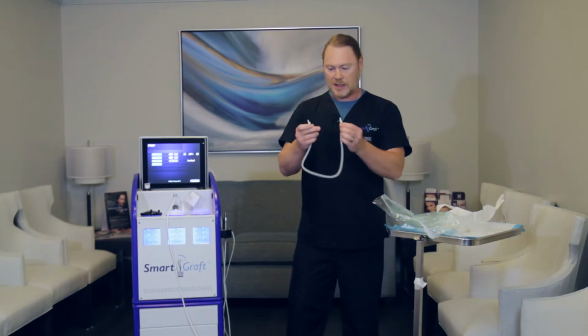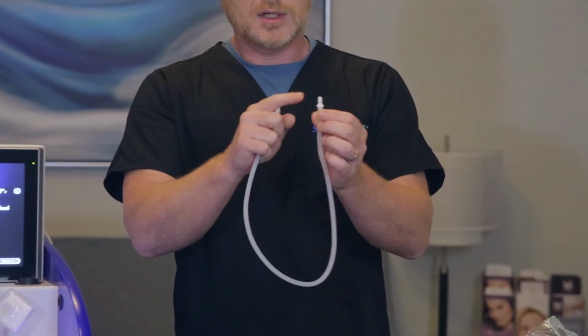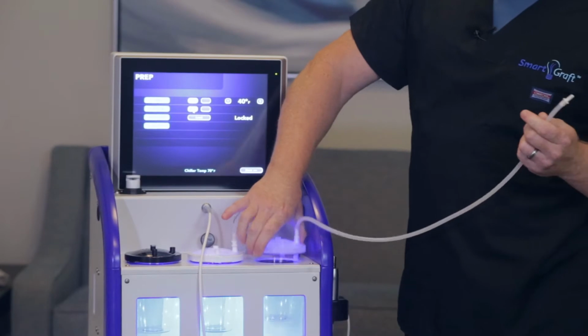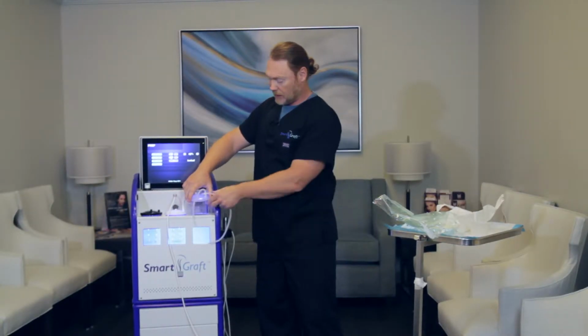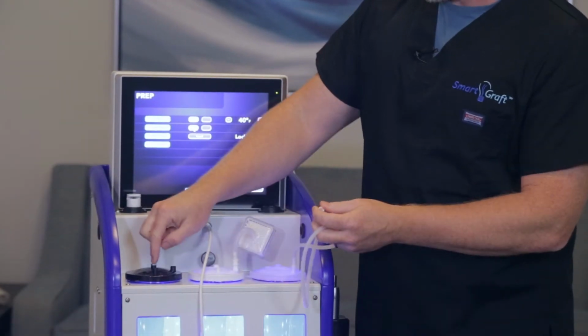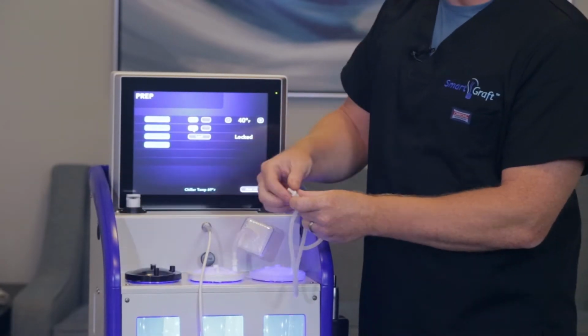The second one is kind of wrapped up into a little ball here for you. Just open it up. This has 2 different tips on it. One is wider, one is thinner. This wider one is going to go on in the position where the tube actually comes down into the saline, because it's going to grab the saline and take it over to the graft canister. So this one is going to go way over here to the center nozzle. This center nozzle here is actually the sprayer that sprays the grafts and keeps them moist.